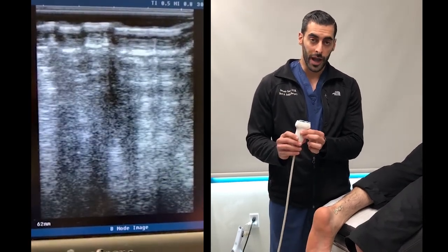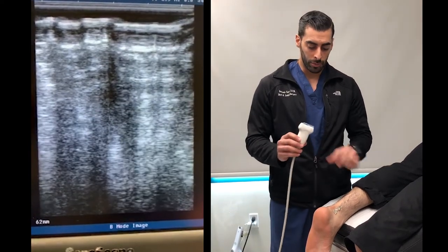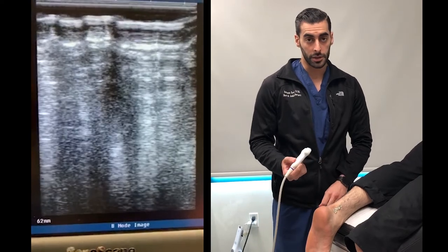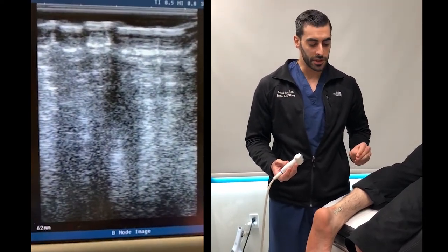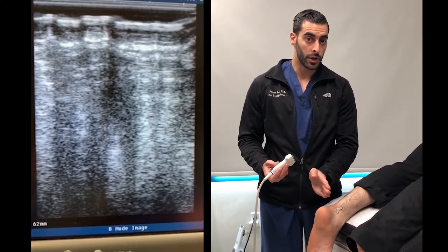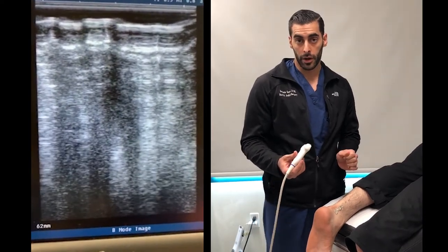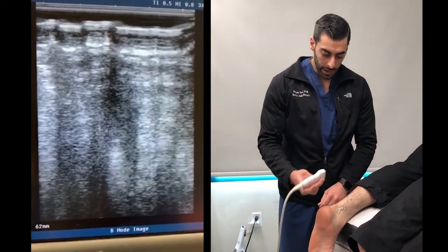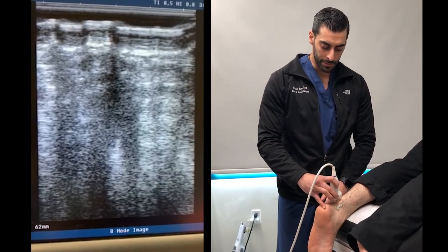We want to do the long axis, which is parallel to the long axis of the leg. The probe will be placed accordingly, and then the transverse or axial view will be perpendicular to the long axis. You want a system when doing this type of imaging — you could either start from the myotendinous junction and work down to the insertion, or vice versa. You want to do that in both the longitudinal and in the axial views. We'll start with the longitudinal, beginning from the insertion and moving up to the myotendinous junction.